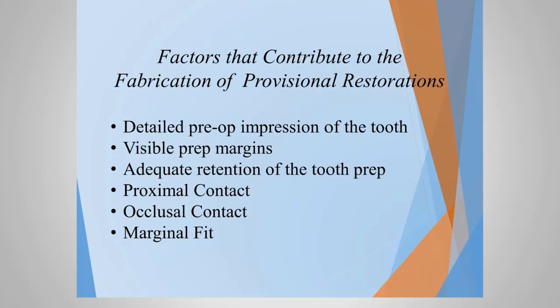Factors that contribute to the fabrication of these temporary restorations: detailed pre-op impressions, visible prep margins, adequate retention of the prepped tooth, proximal contact, occlusal contact, and marginal fit. These are all factors that play a part in how I make temporaries.